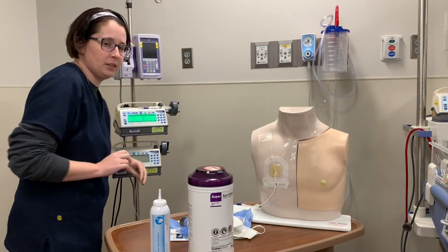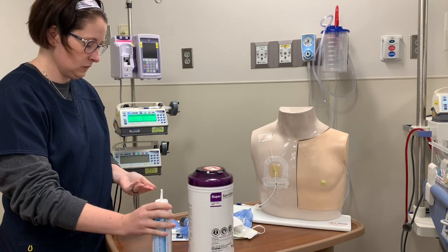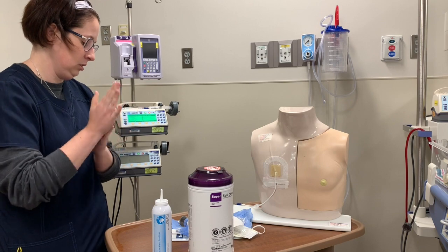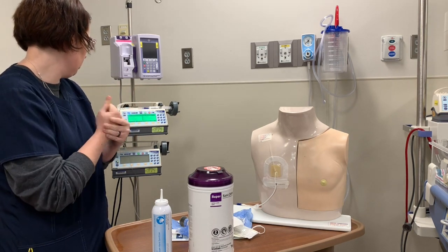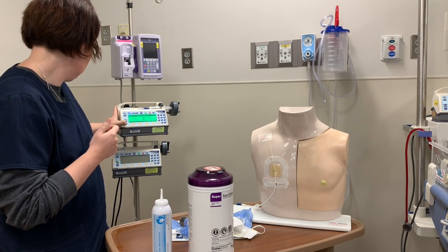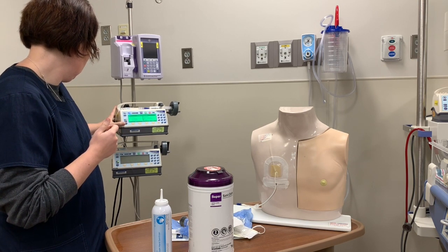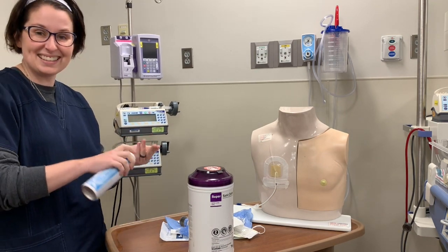I'll put them on my nice clean workstation, then come in and wash my hands. I'm going to stop my patient's pump — or in this case, we'll just shut it off. Now, since I touched the pump, I'm going to wash my hands again.